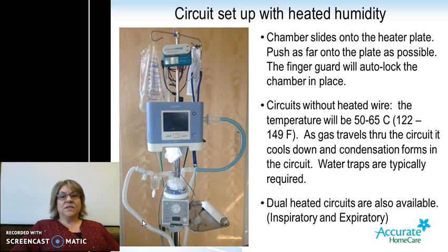The chamber itself slides onto the heater plate. You want to push it as far onto the plate as possible. The finger guard will auto-lock the chamber in place.